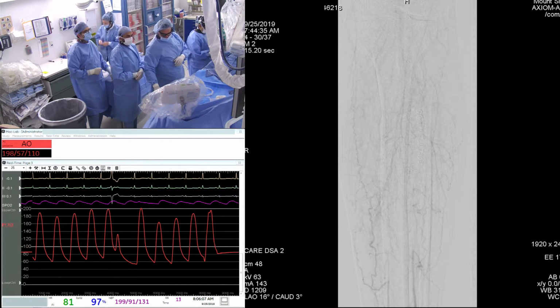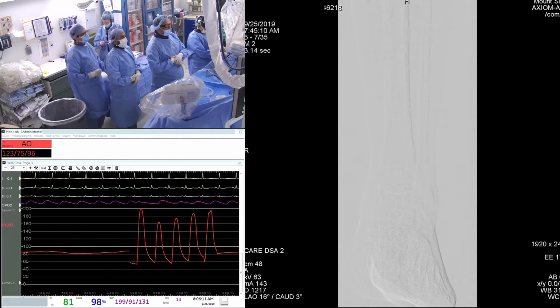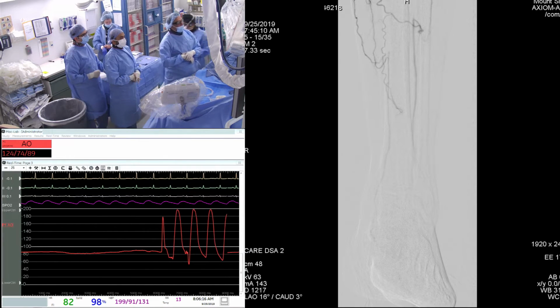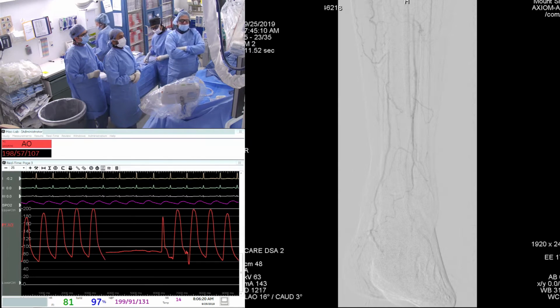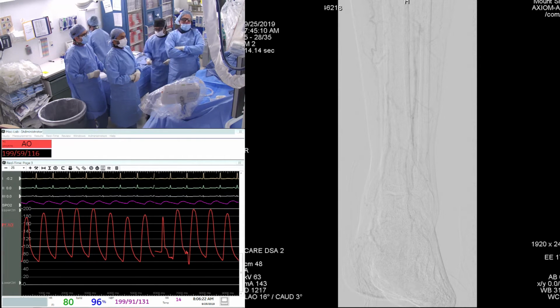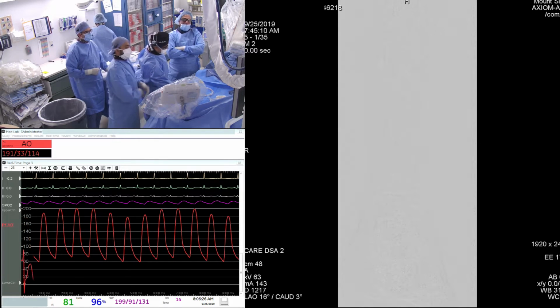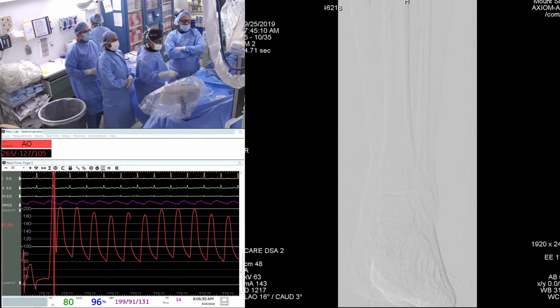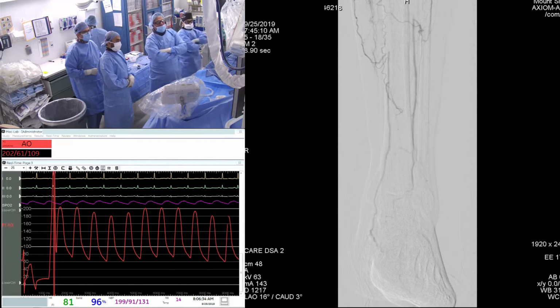And then when you go down to the foot, you can see that at the level of the foot, you definitely have two vessels in the foot. So to me, the reason we decided to choose this case is it really provides us with a lot of information or a lot of questions on how to manage. So here's a gentleman, obviously, who has a lot of risk factors and has significant claudication. He's a youngish patient who possibly is a candidate for surgery.